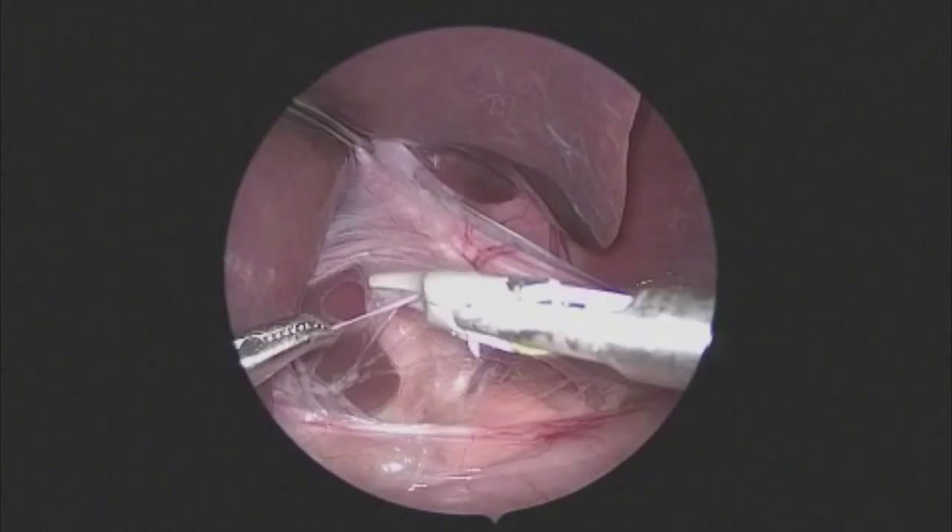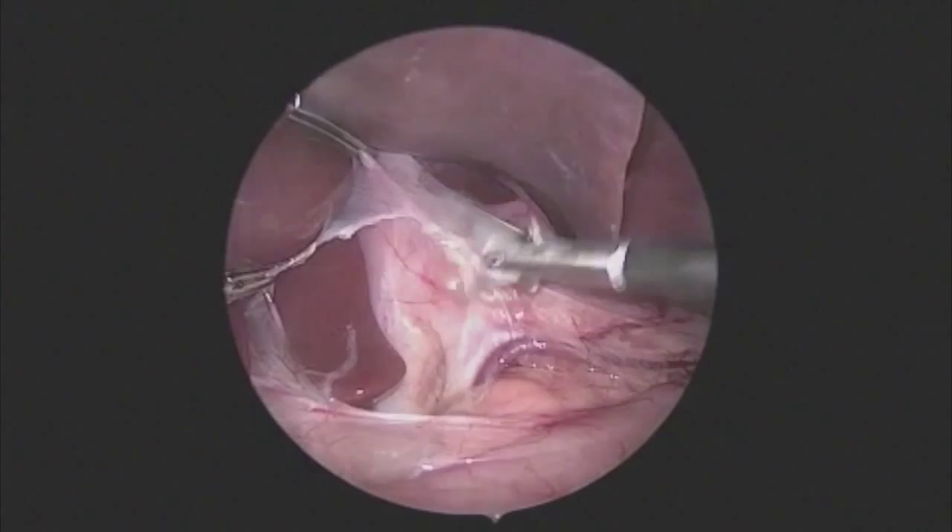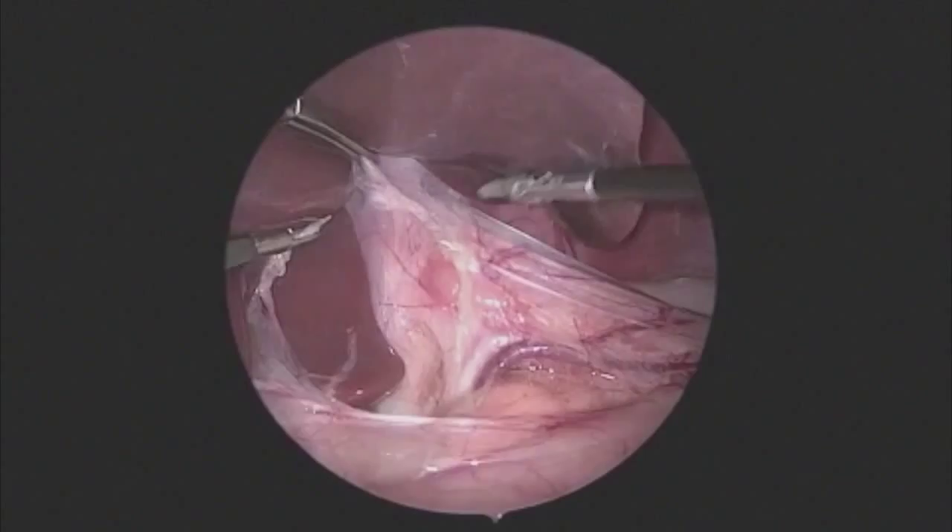The three millimeter JRS sealer is used to take down the very transparent and see-through gastrohepatic ligament. Occasionally there is an aberrant left hepatic artery in this area and that vessel is usually preserved. Because of the thin nature of the tissue, it is easy to tear after being sealed.